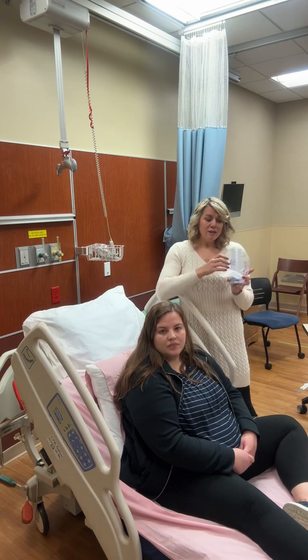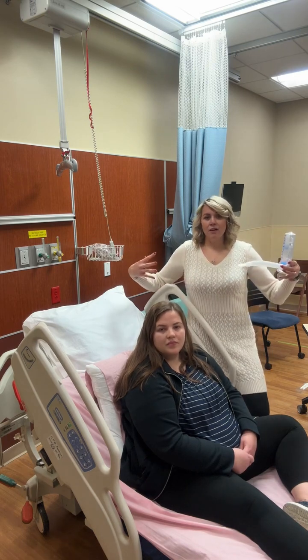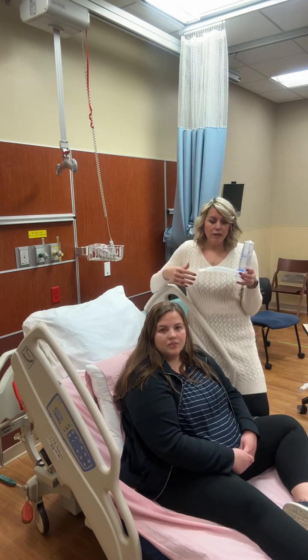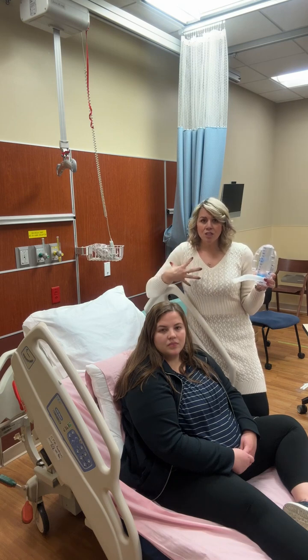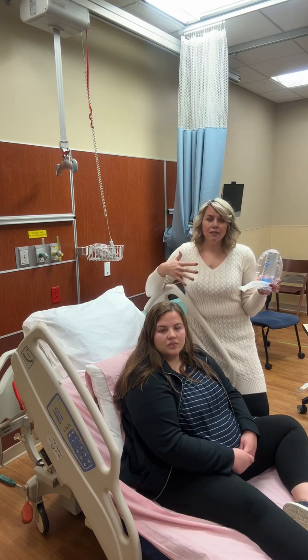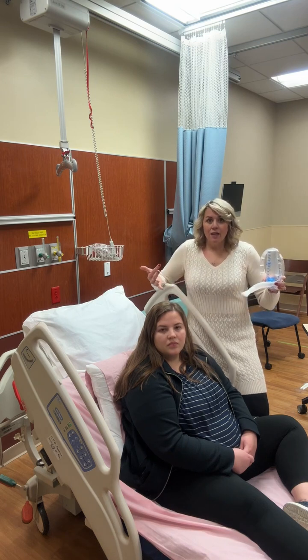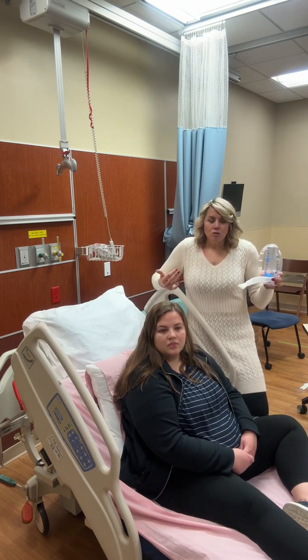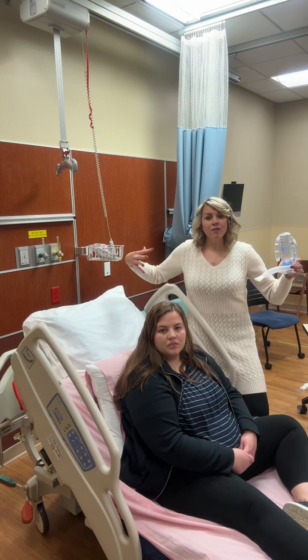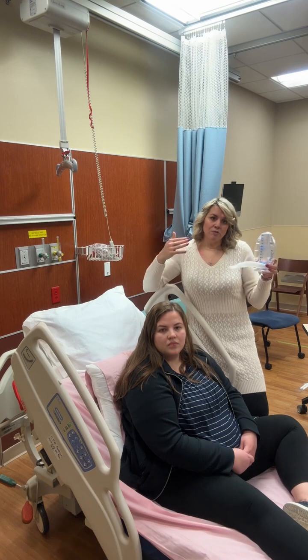So the reason that we use these incentive spirometers is to increase the capacity of the breath. So we are expanding the lungs. And why would we need this? Patients who have lung restriction, like chest trauma, they were in a car accident, they had open heart surgery. Typically, if you're in pain or you've had some sort of trauma to your chest cavity, you're not going to be able to take a deep breath in. You're going to be taking slow and shallow breaths, and when that happens, our lungs don't expand all the way, and then we start stacking our breaths, and pneumonia can set in because we've not expanded them.